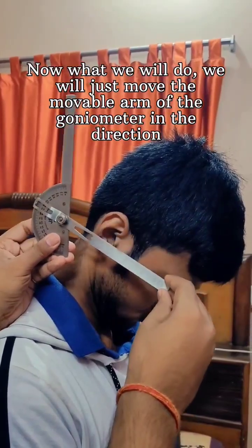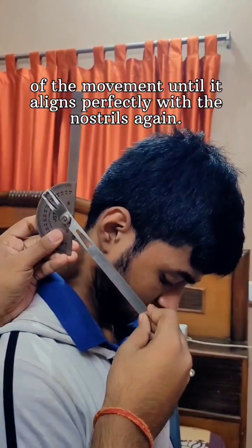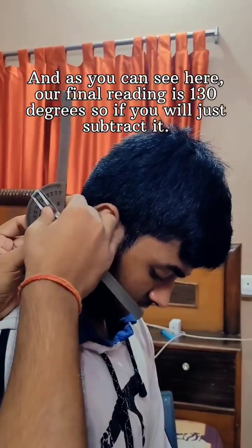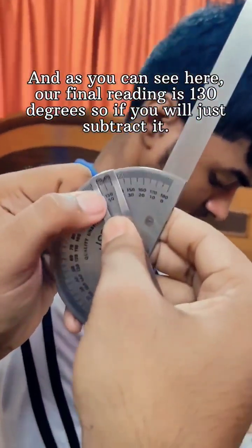As you can see, our patient has performed the movement. We will move the movable arm of the goniometer in the direction of the movement until it aligns perfectly with the nostrils again. And as you can see here, our final reading is 130 degrees.